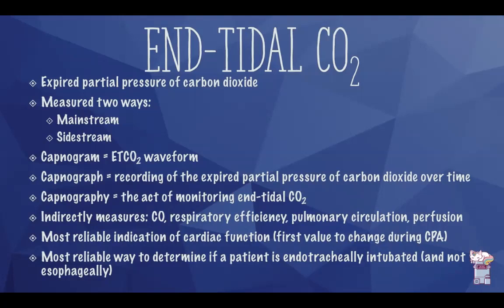End-tidal CO2 indirectly measures and can represent cardiac output, respiratory efficiency, pulmonary circulation, and overall perfusion. This value is one of the most reliable, non-invasive indicators of cardiac function and is one of the first values to change during cardiopulmonary arrest. It is also one of the most reliable ways to determine if a patient is endotracheally intubated and not esophageally intubated.